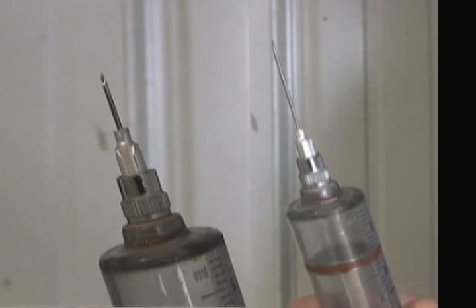Select the appropriate needle length for the type of injection you are giving. The shorter needle on the left, 5/8 of an inch or less, is for subcutaneous injections. The longer needle, 1.5 inches in length, should be utilized for intramuscular injections.